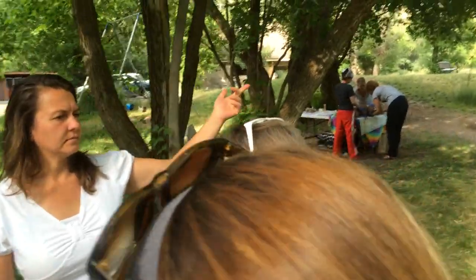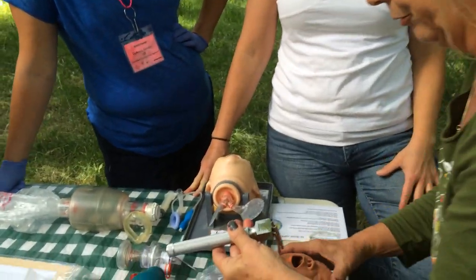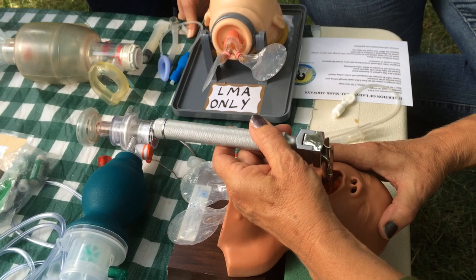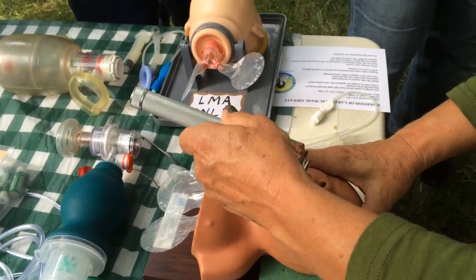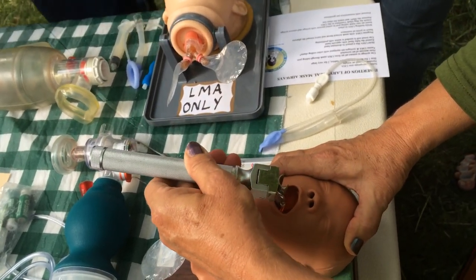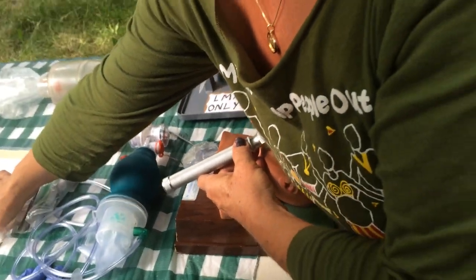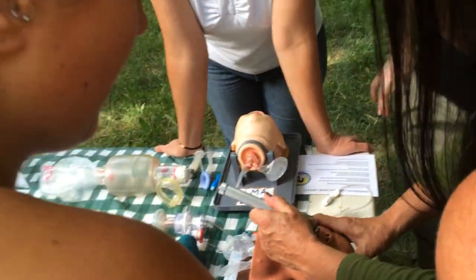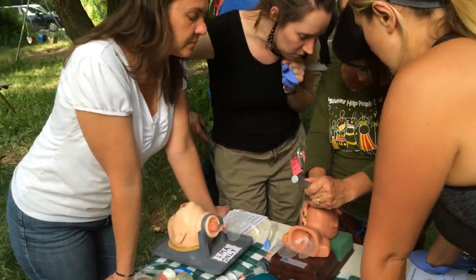When you use this, you open it up so that you can see that the light's working. You hold the baby's head still, and you go all the way to the back of the baby's tongue, and you lift up. When you lift up, you see the two white lines? Those are the vocal cords, the little white lines, and that's where you're going.